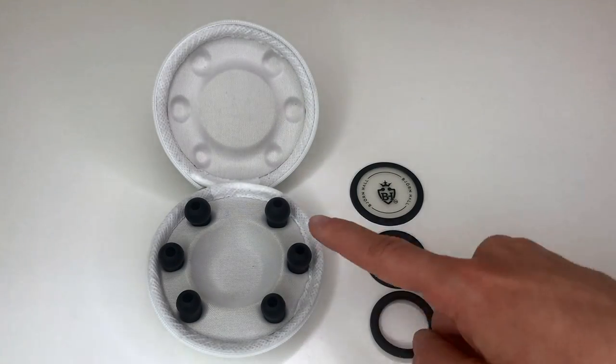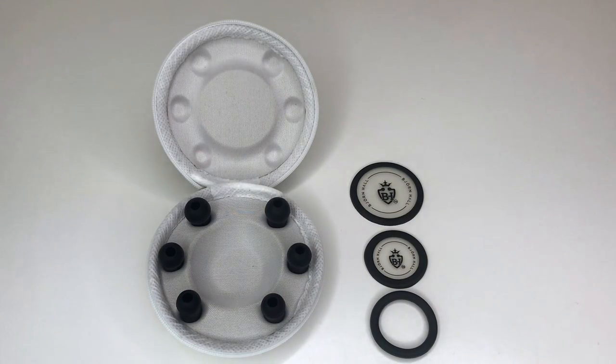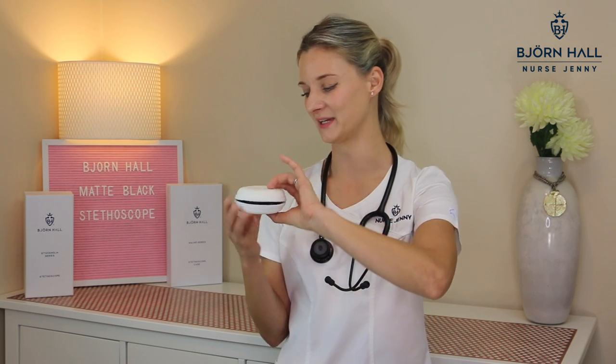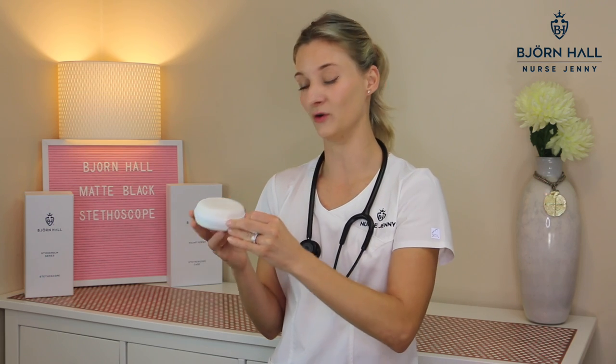The spare kit does not disappoint. Along with your stethoscope, you'll receive a spare kit with three extra ear tips — size small, medium and large — two extra diaphragms, a small and a large, and a non-chill rim if you want to convert your paediatric diaphragm into an open bell. It also comes in this cool little carry case that you can keep in your bag, your locker, or at home.